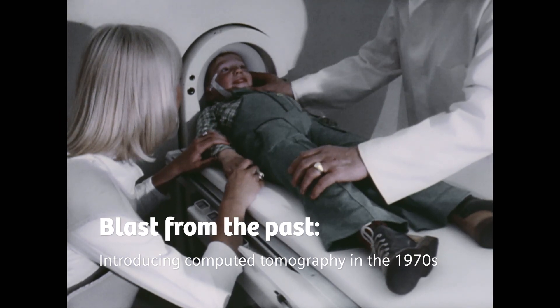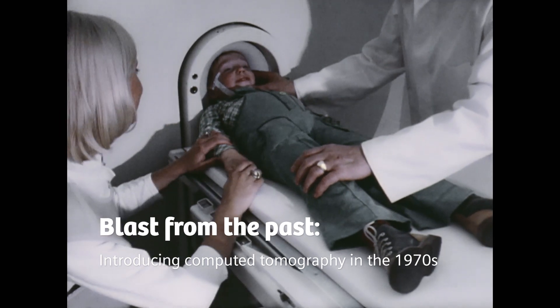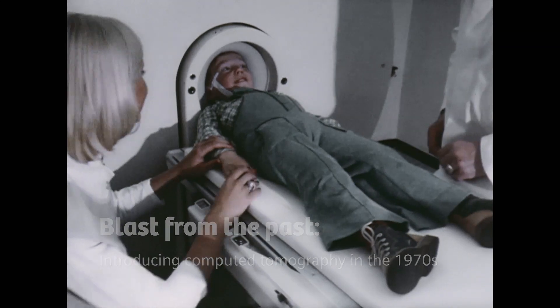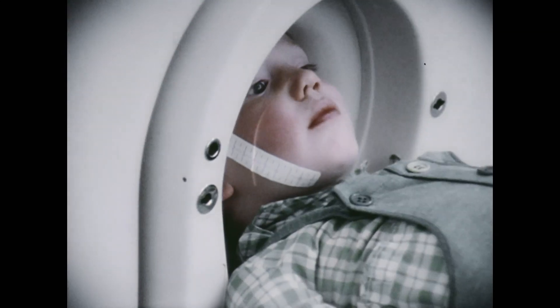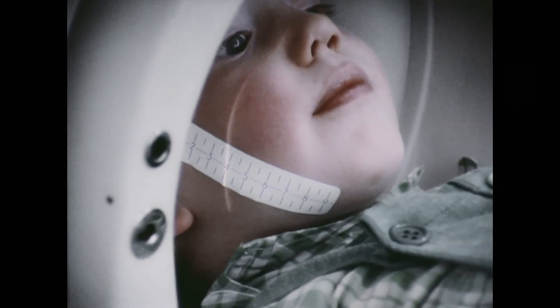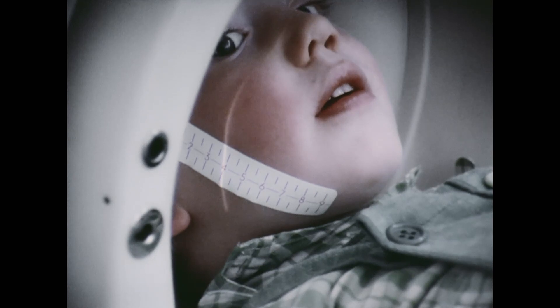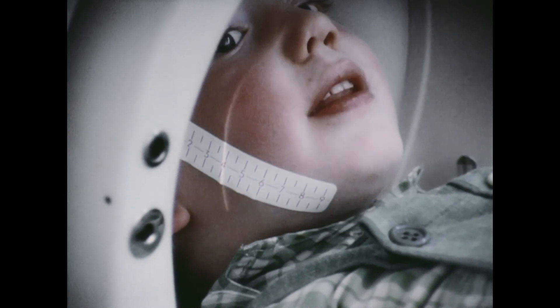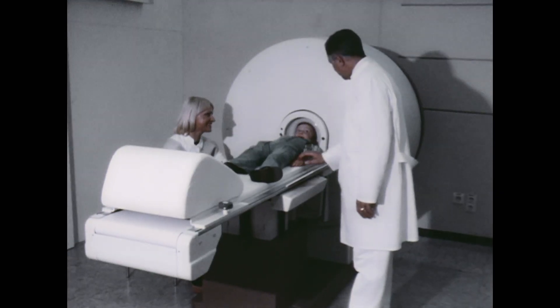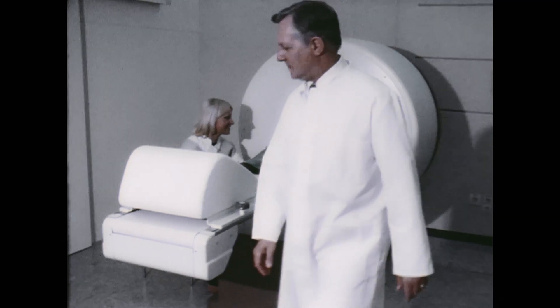The new technique of computerized tomography, here being used on a young patient, allows a completely pain-free examination of the patient without the need of any sort of intervention. For many patients, this technique eliminates a stay in hospital.